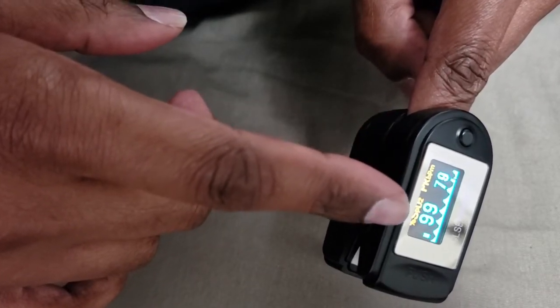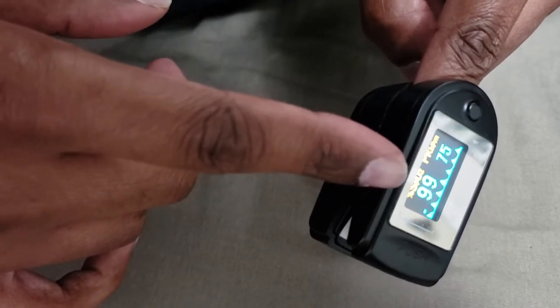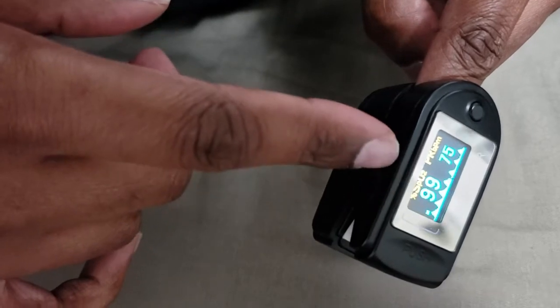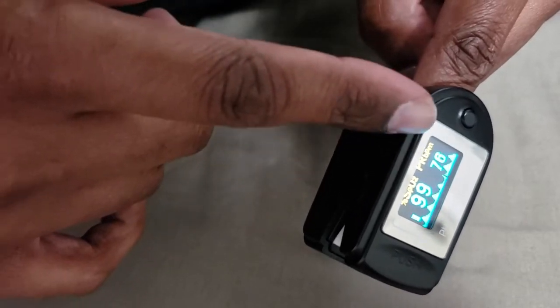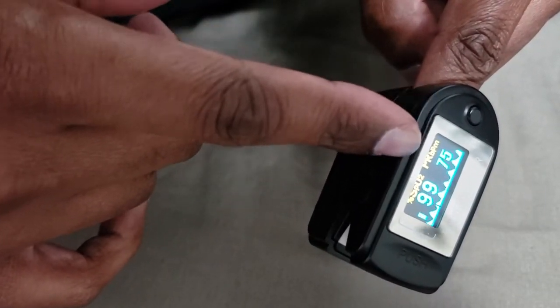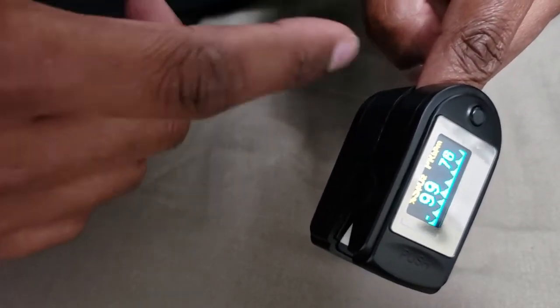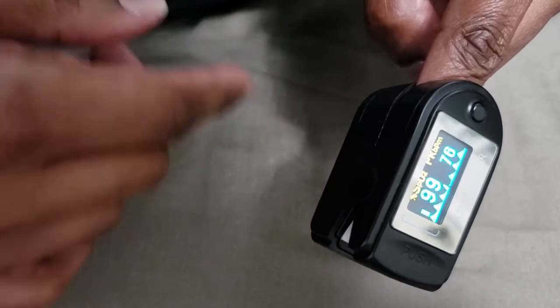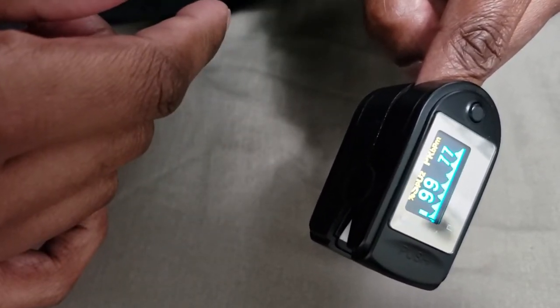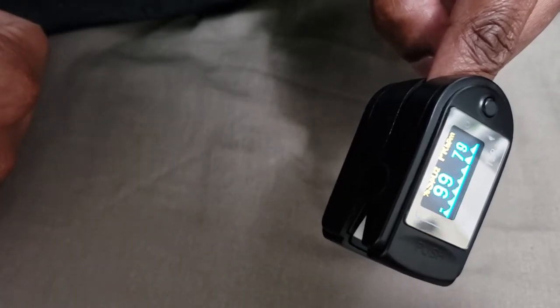Now, when this number goes down, the blood oxygen level, sometimes what happens in pneumonia is your oxygen level will go down. So say this says 94, okay? You might see the pulse go up. So the pulse, if it's usually 75, maybe it's up at 100. And that could mean that your heart is beating really fast, trying to get more oxygen into your body. Because there's decreased oxygen going into your lungs, so your heart is trying to beat faster, trying to just get that oxygen into your body.